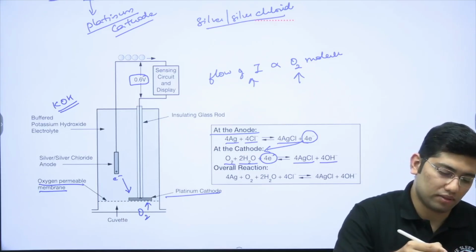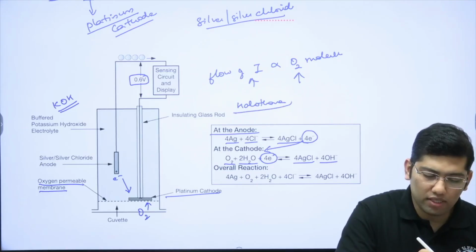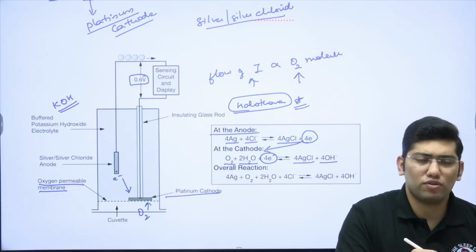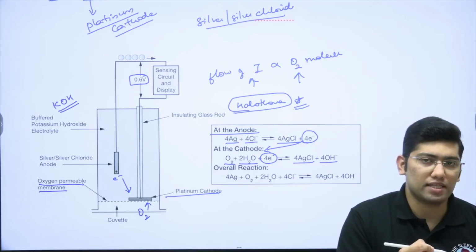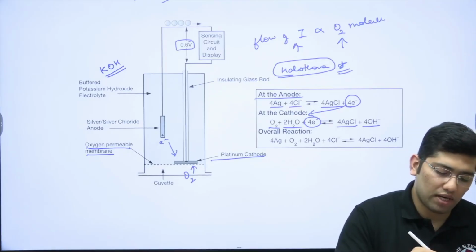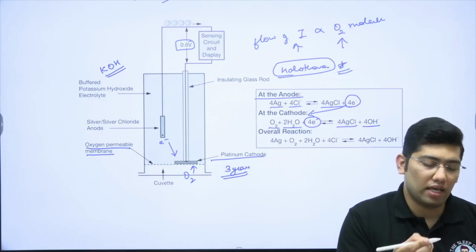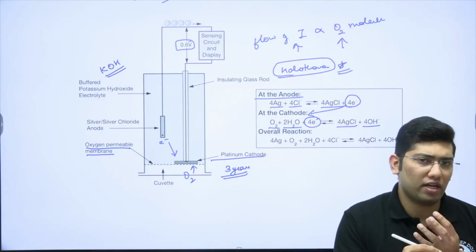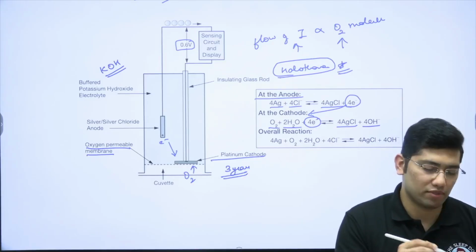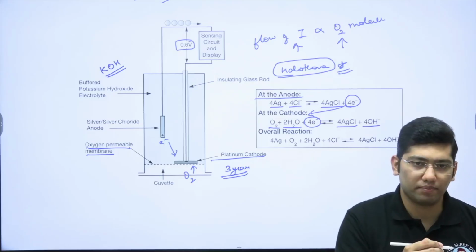Now halothane, to be remembered here, gives a falsely high reading of PO2. This can be prevented by using a halothane impermeable membrane. That's it. And now coming to the lifespan of these. This cathode has a lifespan of 3 years due to protein accumulation. The protein accumulation can be prevented by having a membrane around, but then it greatly reduces the response time. So that is not feasible. And also the silver anode tends to disintegrate over time.